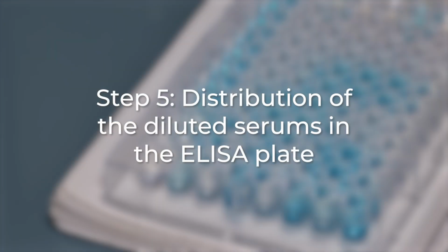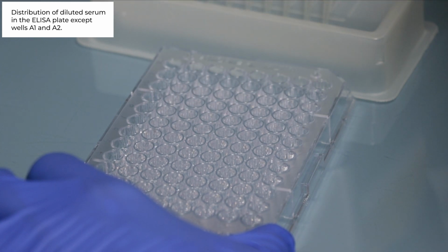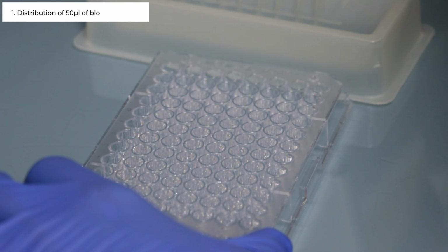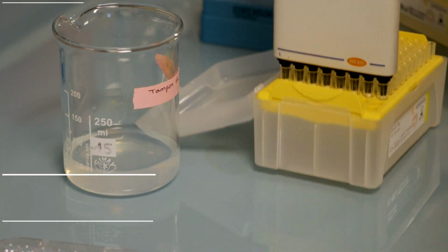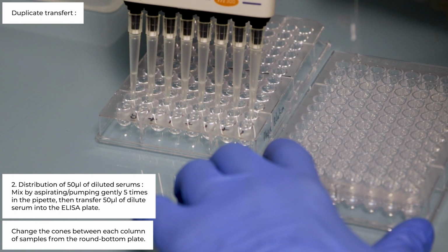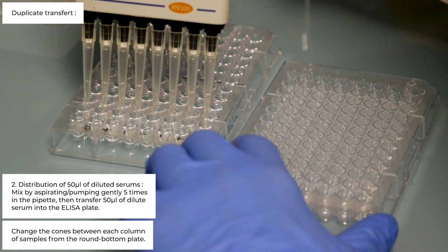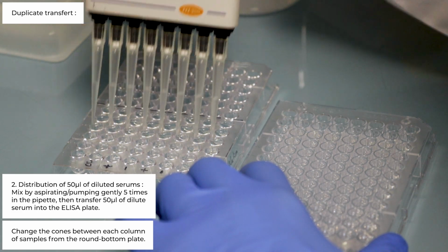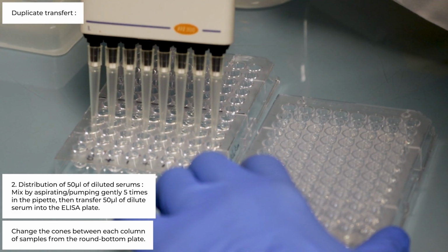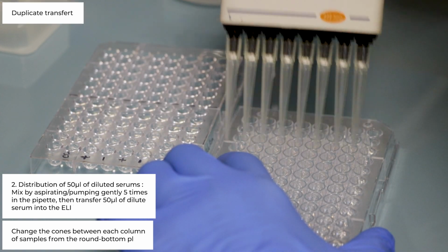Step number 5. Distribution of the diluted serum in the ELISA plate. Distribution of diluted serum in an ELISA plate is made at the exception of wells A1 and A2. First, distribute 50 microliter of blocking buffer. Second, distribute 50 microliter of diluted serums, mixed by pipetting in and out gently 5 times, and transfer 50 microliter of diluted serum into the ELISA plate. Change the cones between each sample column of the U-bottom plate. The final dilution is 1 in 100.